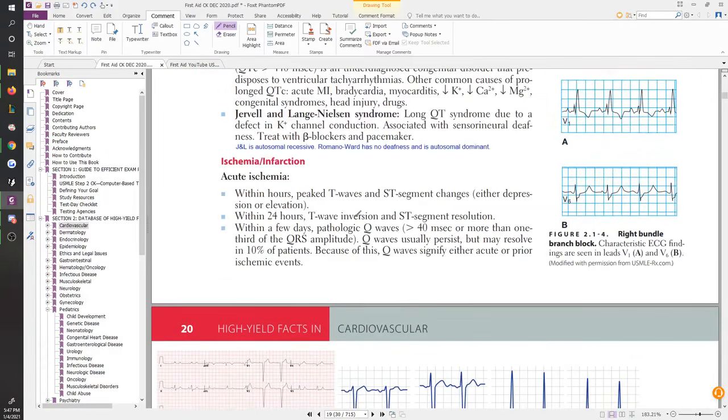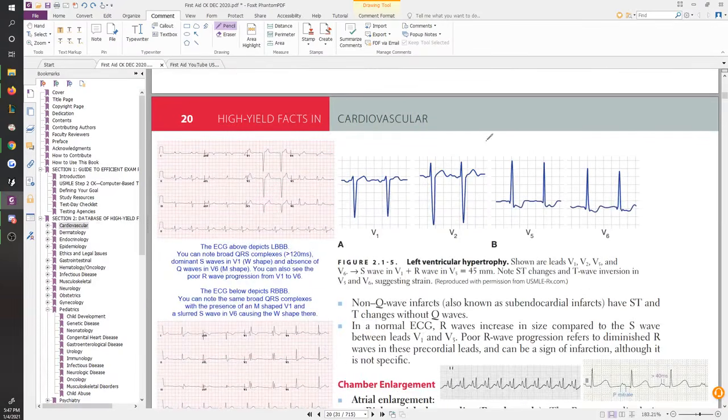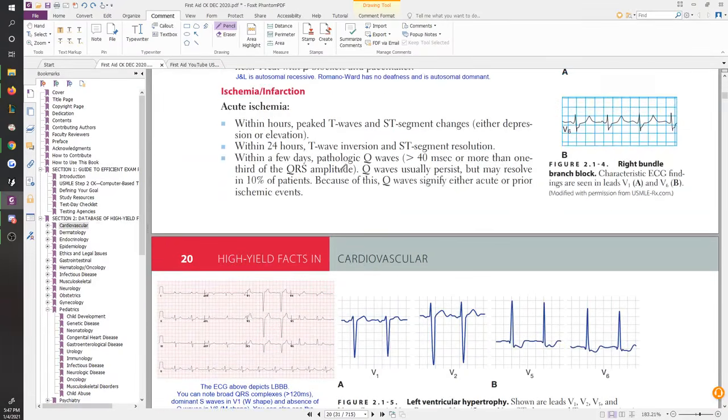The other thing is working with the ischemia and infarction stuff, right? The ischemia and infarction stuff we talked about very similarly in step 1 as well, where it was topics about the progression of an MI, what happens when a person comes in with an MI. So if a person has an MI, one of the key things you're almost always looking for are ST changes, right? Either ST elevation, so that's an ST elevation MI, a STEMI, or an N-STEMI, which is a no ST elevation, which usually means it's going to be an ST depression MI, right? And those two facts actually tell you things, right?